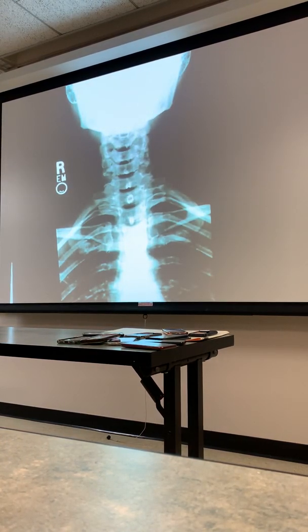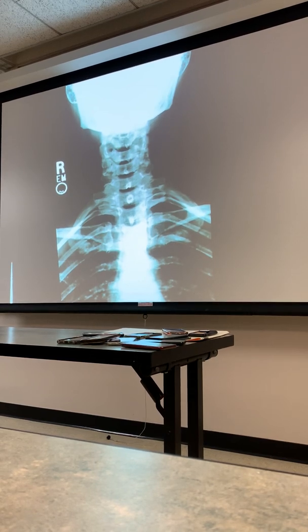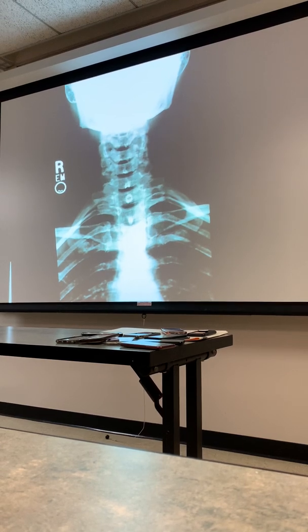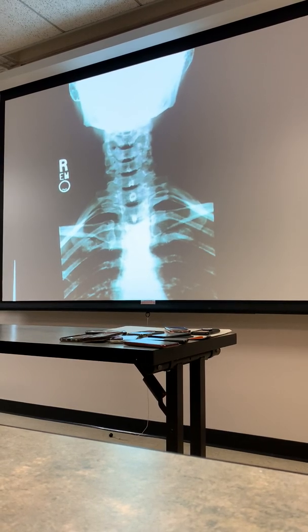So that's a little better. At least you can see 3. So there's T1 here, 7, 6, 5, 4. You guys can't see it, but I can see it on my fingers here. So here's 3 in here. Any questions? AP? Okay. Obliques.